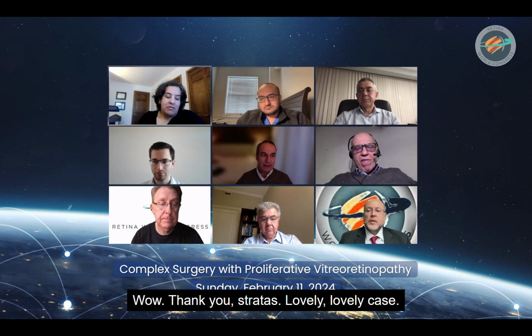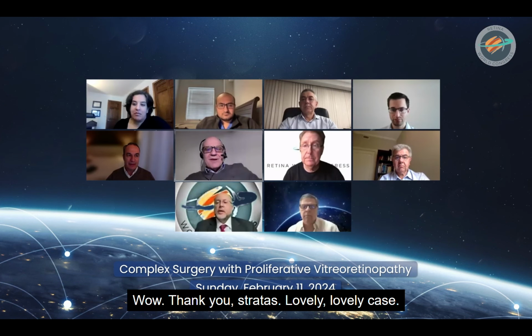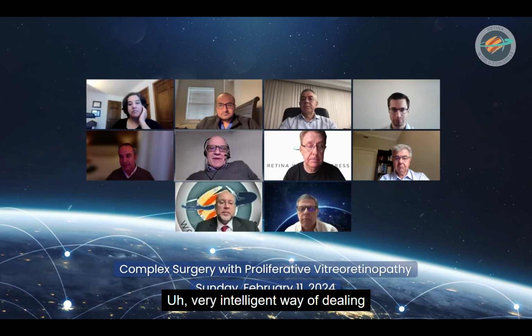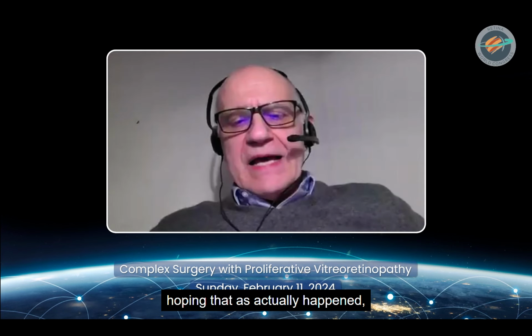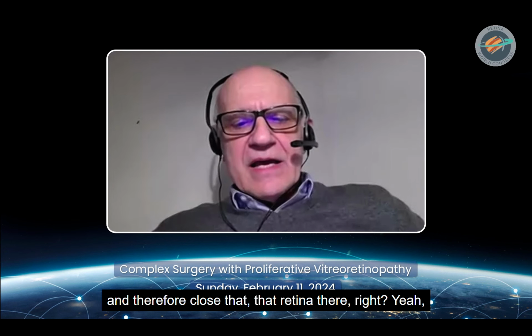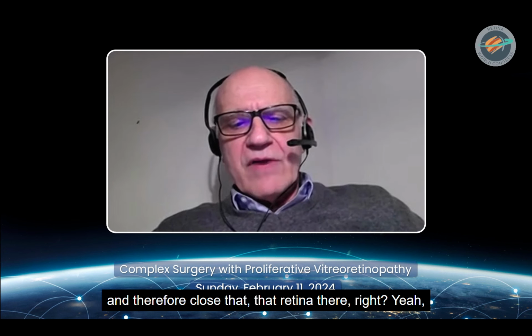Wow. Thank you, Stratos. Lovely, lovely case. A very intelligent way of dealing with a very complex case. So in other words, you're using the ILM to bridge the gap, hoping that, as actually happened, proliferation will happen on the surface of the retina and therefore close that retinal tear.